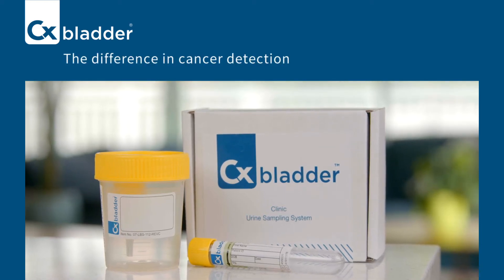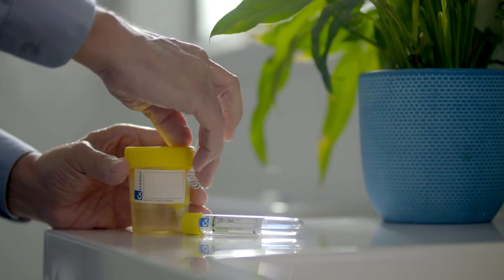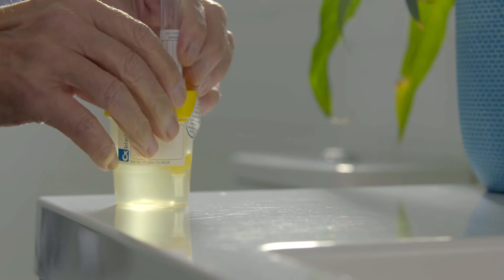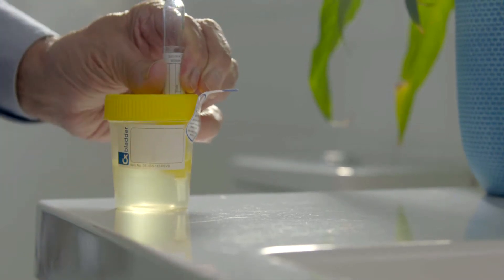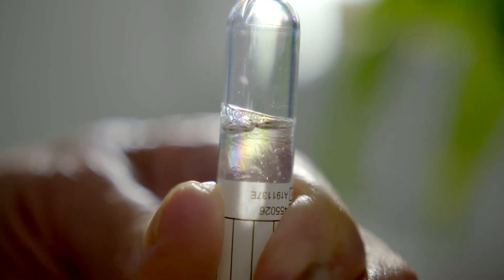Welcome to the CX Bladder In-Home Urine Sampling System demonstration video. CX Bladder is an accurate, non-invasive bladder cancer detection test that includes a simple and innovative urine sampling system for easy sample collection and transport to our lab for analysis.